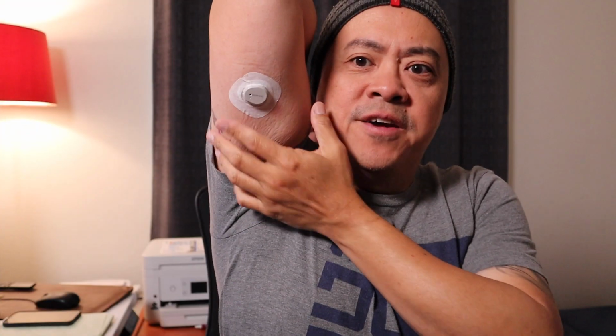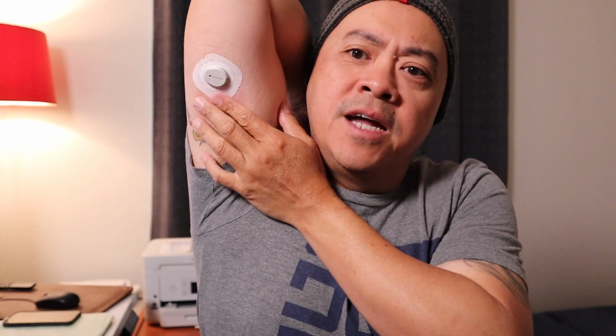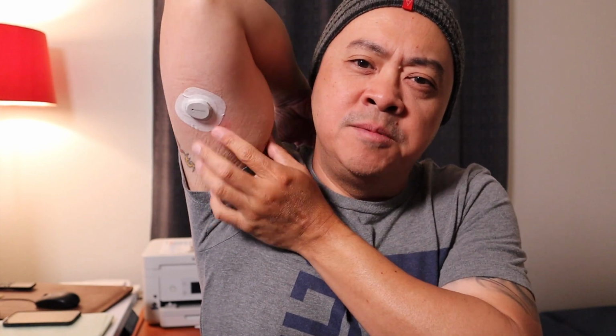What I'm going to do now is install the overpatch and see how that feels. So there it is, I got the overpatch on right there. I don't know how I feel about this overpatch. It seems a little flimsy, and it's kind of squiggly when you first put it on. So I think having somebody else help you would make the process a little bit better. But it's not impossible to do it yourself.